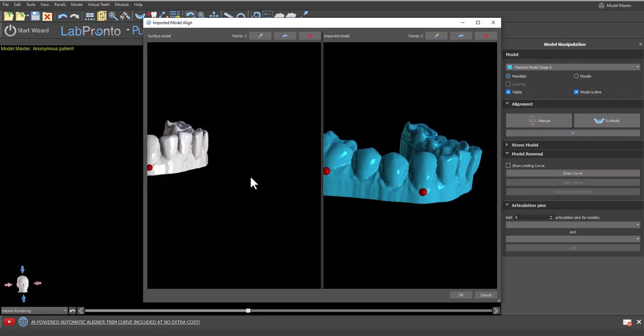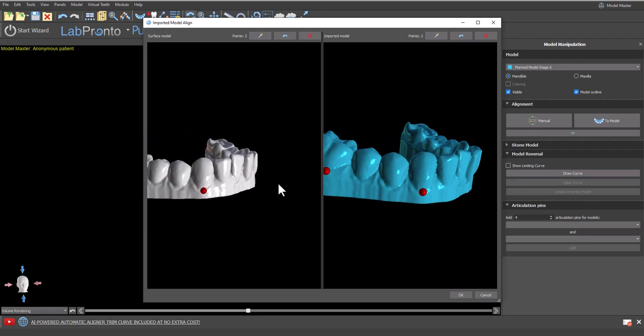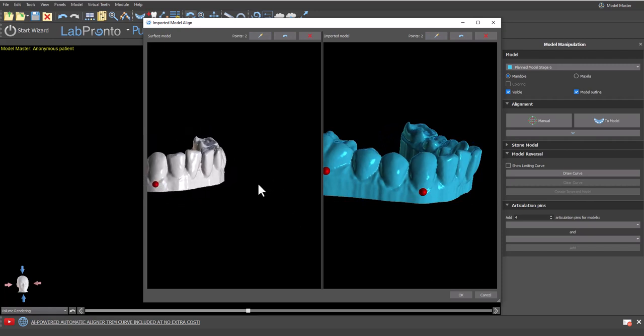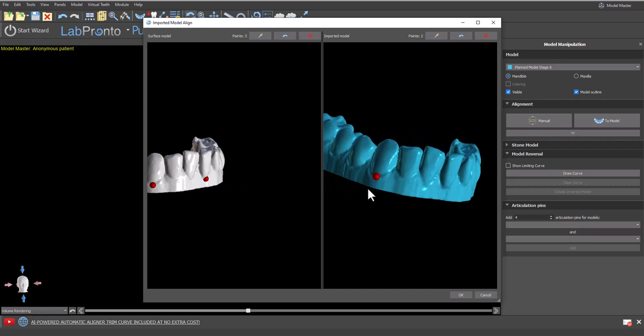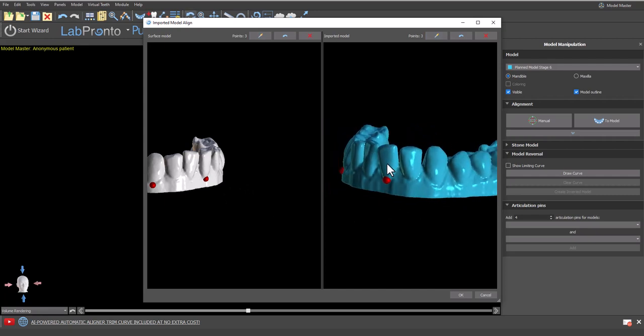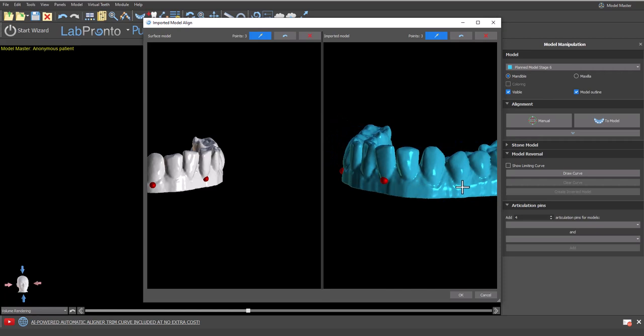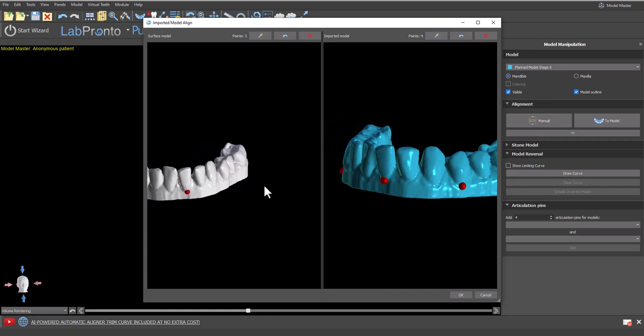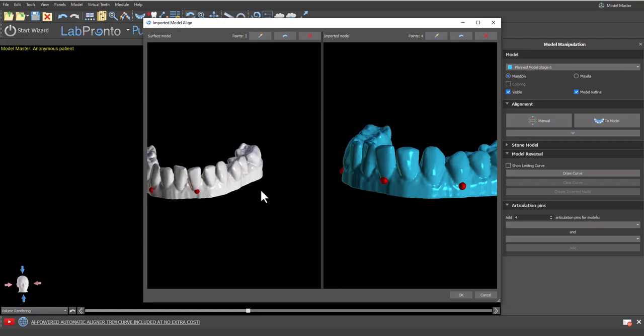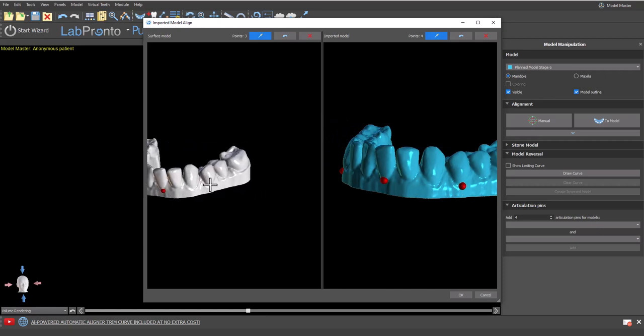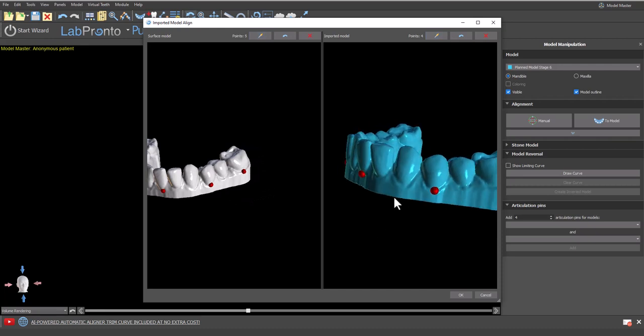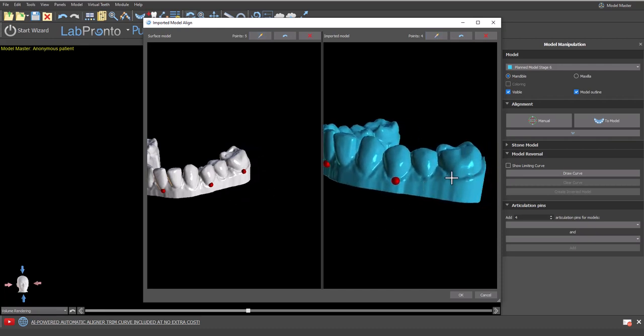Okay, we can place all the points in one model and then the other model or we could place one point on one model and then one point in the other model as I'm doing now. Either way is completely fine. What is important is that we want to disperse the points throughout the models and we want to go ahead and place at least four or five different points. Once we've done that, go ahead and click ok.